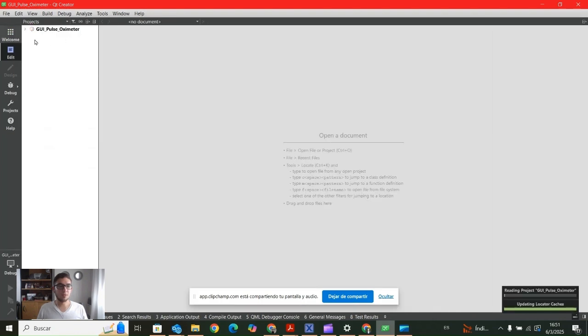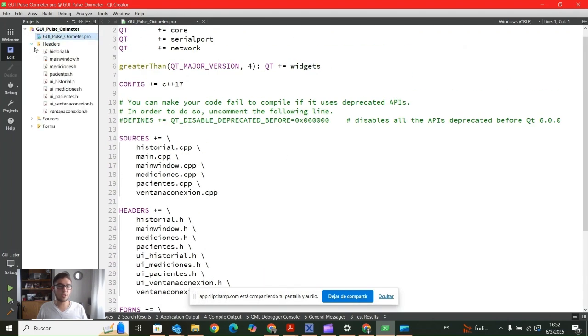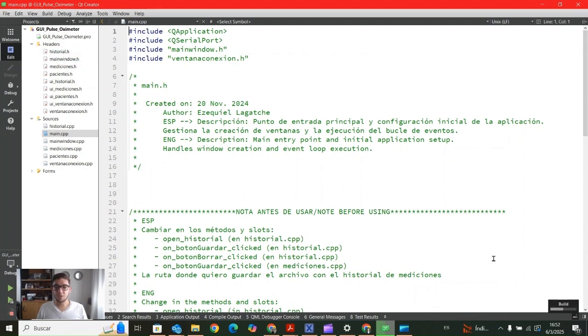We open it, we wait. When it finishes, we can see that we have the entire code. All the code has been commented and everything is on GitHub, so you can check it and take a look if you want. It's not necessary to be in any specific window or any specific file actually. We can be at main.cpp if you want, and we are going to compile this code first. We're going to wait until it's built.